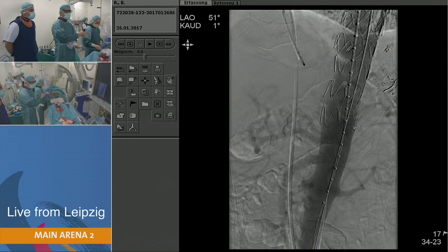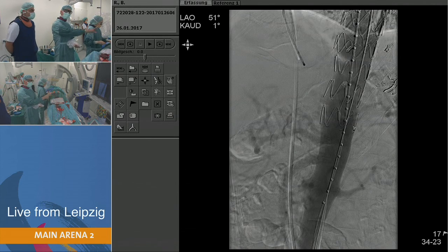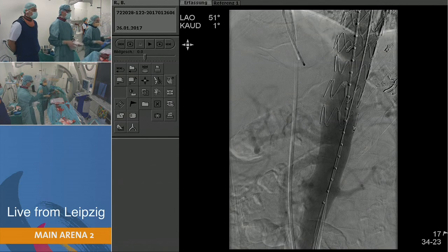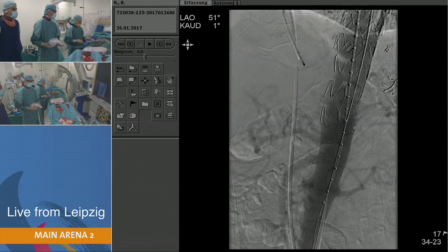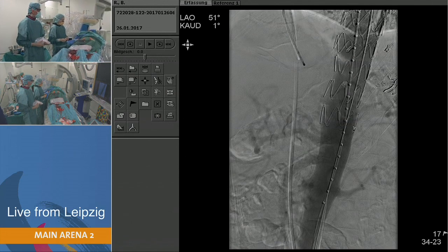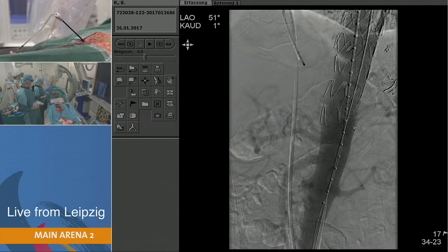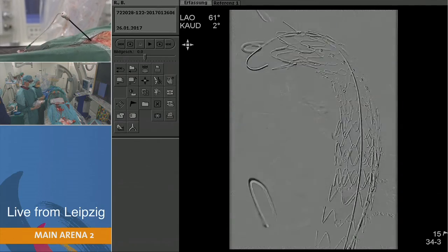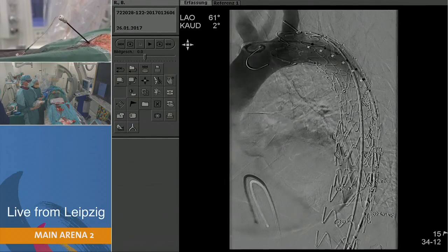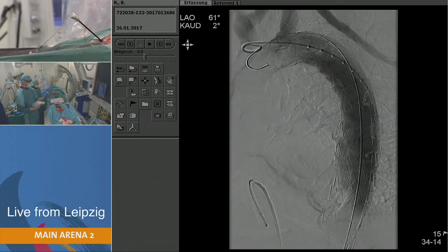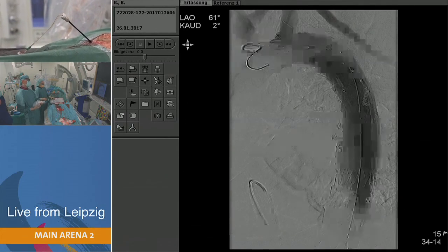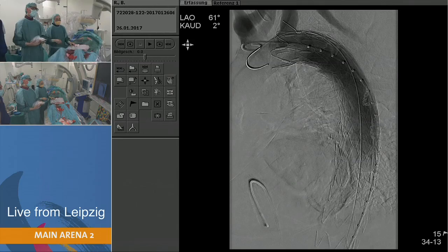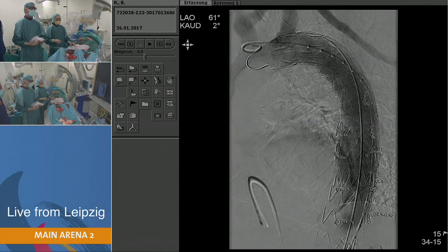With a 23-French sheath and two ProGlides, there was actually no problem closing the groin. We are quite happy with the results. Any comments from the panelists? It looks beautiful. Good job — that's the verdict from the room. Congratulations.